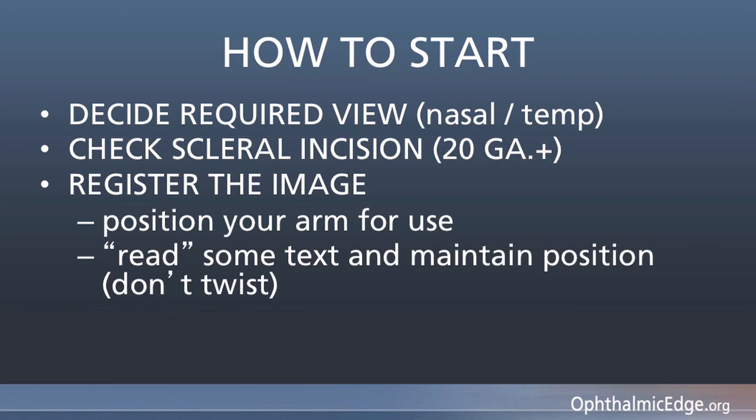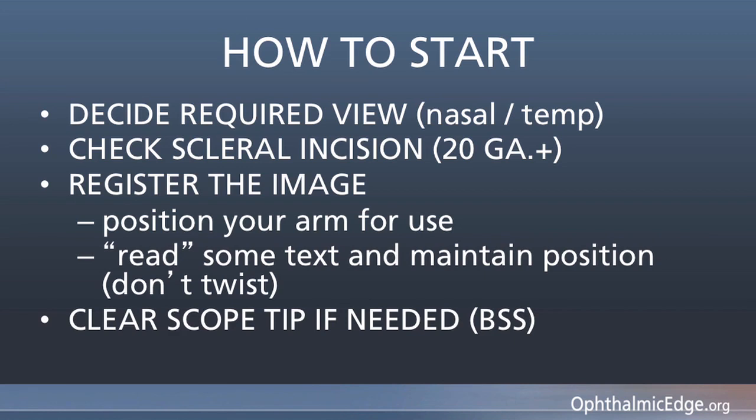I will then focus posteriorly to see what's going on in the posterior portion of the eye and get as good a view as I can of the optic nerve and macula, being certain that the monitor view is the same as the microscopic view and that movements are similar to an XY device on a microscope, meaning that as I move the endoscope towards 6 o'clock, I see more of the 6 o'clock position. If the tip is clean and the connection has no dust, you are ready to go.